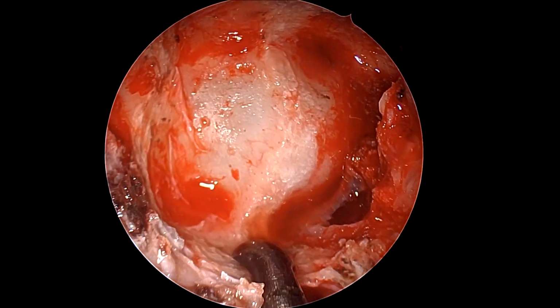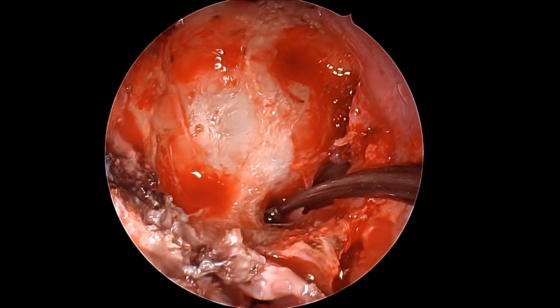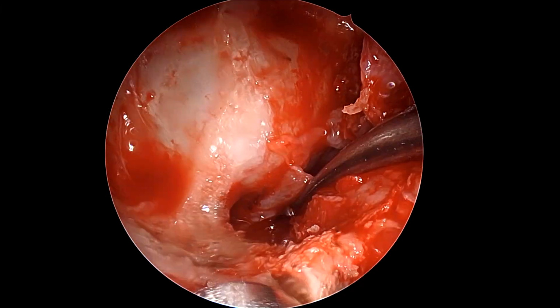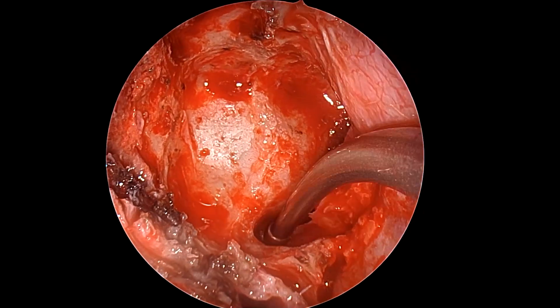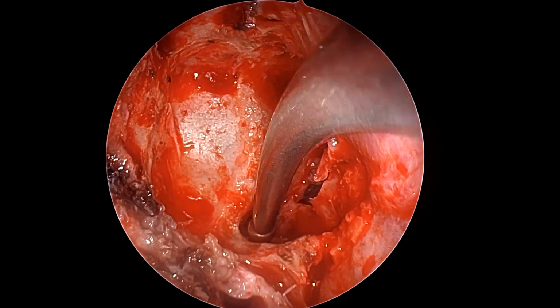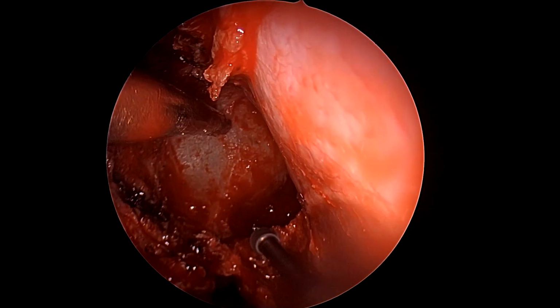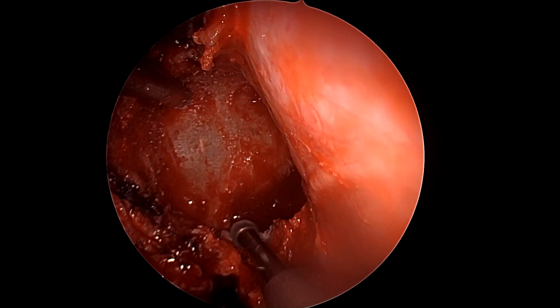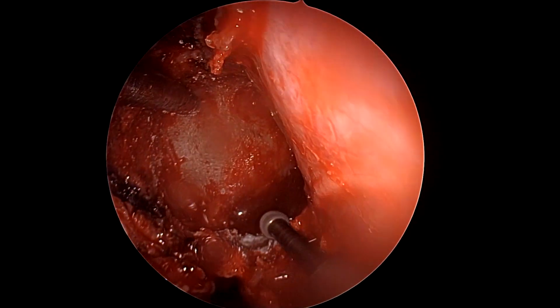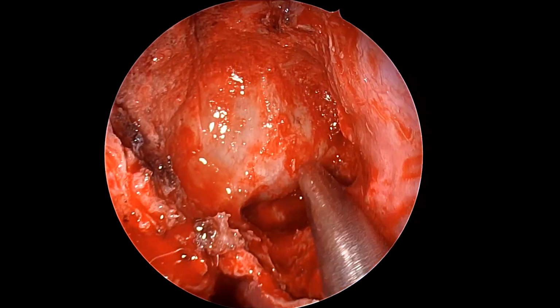We can see some sphenoid mucosa still lying on the left side, which still has to be removed as it is a little down. We can use a curved curette to push and peel this mucosa off the floor of the sphenoid sinus. We can see how a very compressed clival recess lies there because of the push of the sellar lesion from above. What that means is that we need to drill more of the floor of the sphenoid. So again, we come back to our cutting burr to drill more of the sphenoidal floor, so that we have a reasonable amount of instrumentation possible.